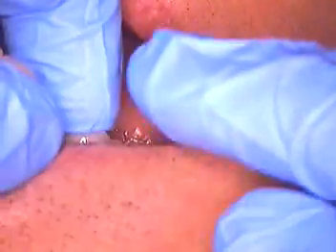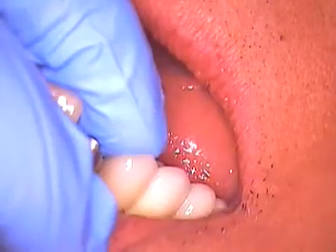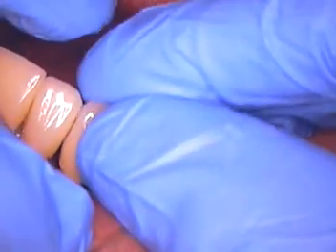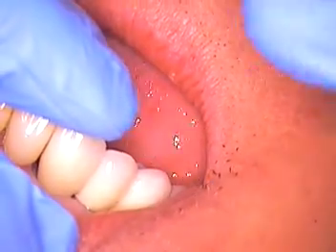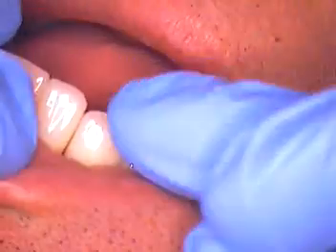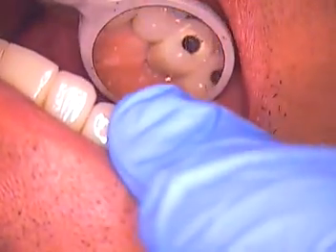So I'm going to hold this on this side. Turn to your left so I can see a little better. So here's the right side. We'll put the last crown in to check contact — I've got to pull the tissue back labially. We are going to pack cord. Do the mesial again. And I'll hold these two. Good, great. Didn't tread, so we got good snap — good long contacts. Space is closed. No complaints.